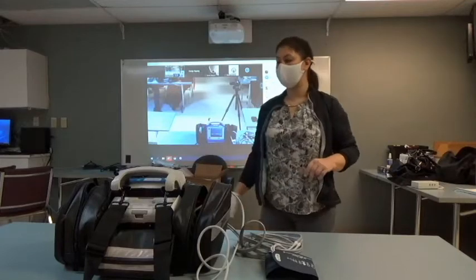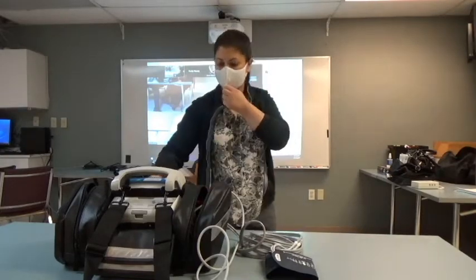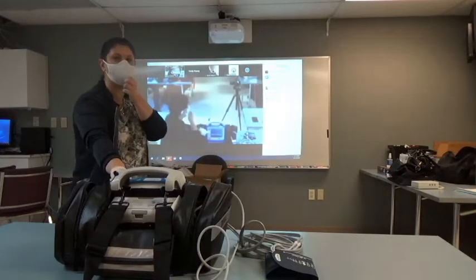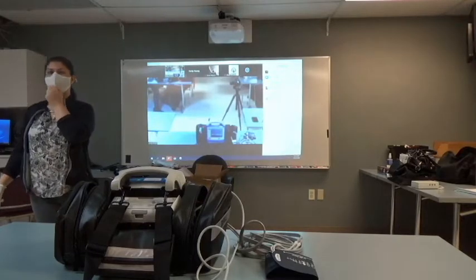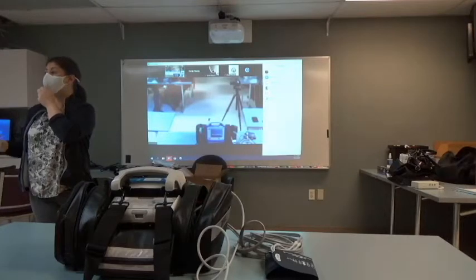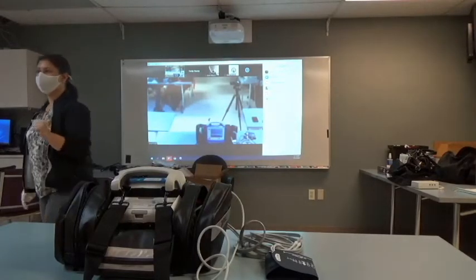I want you guys to pick an arrow, it doesn't matter which one, and start pressing it. As we press this, what color does the cursor turn every time you press it? Blue. I know it's early, not to be cheesy, but here's how I remember it. Anything you can highlight blue, there's something you can do. That means you can customize your device for the duration of the call.